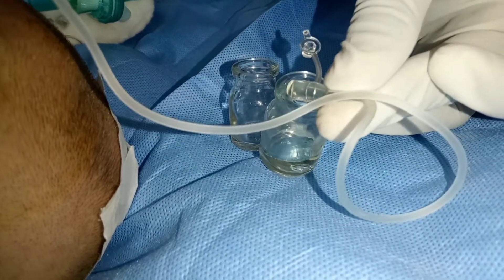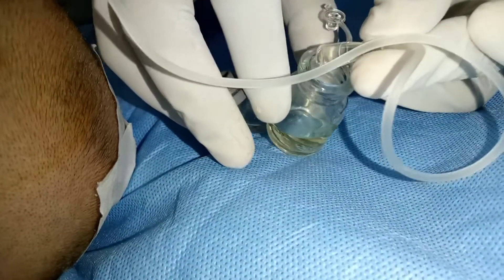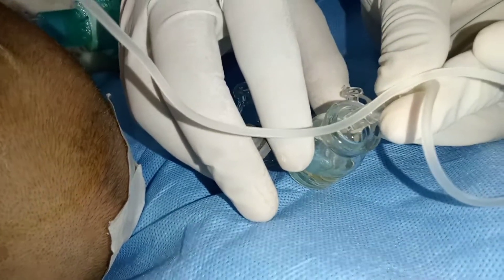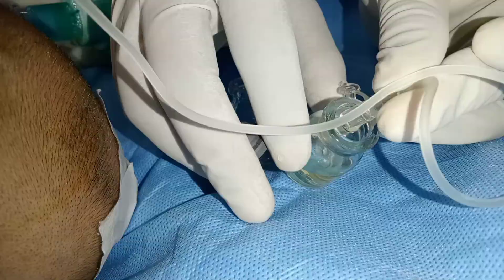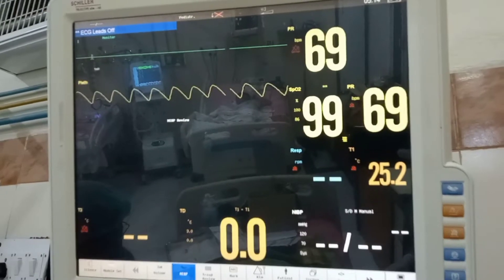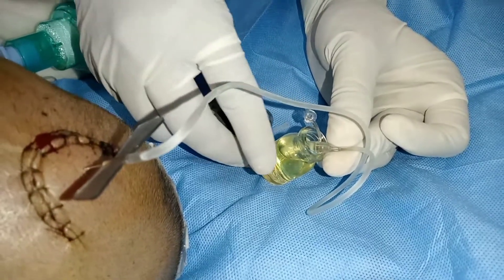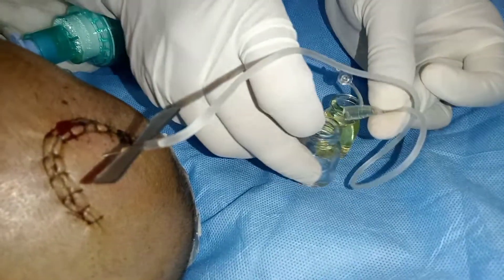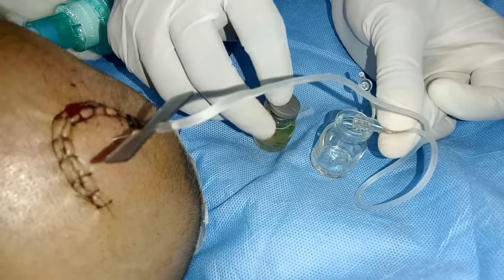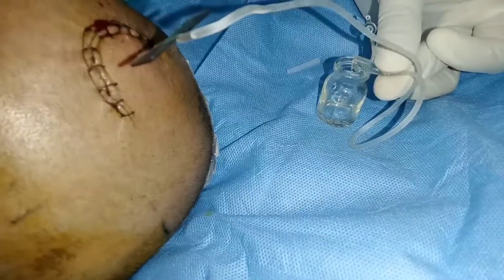Supervision of a neurologist or neurosurgeon is recommended. This procedure should be carried out under cardiac monitoring, at least for heart rate and SpO2. Note how the CSF is being drained drop by drop into the collecting vials. The CSF looks a bit straw-colored due to its high protein content.